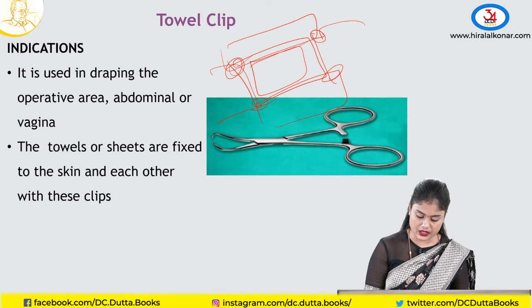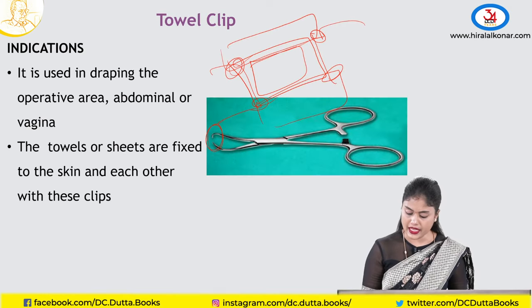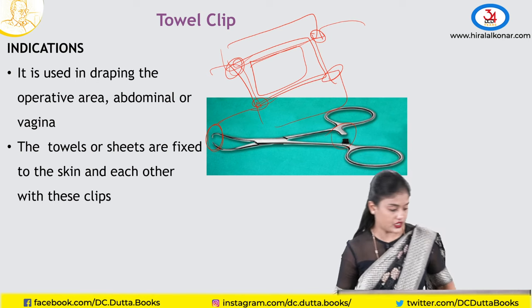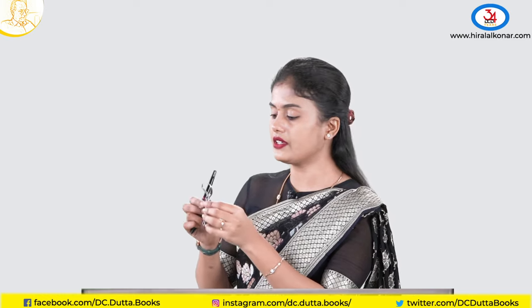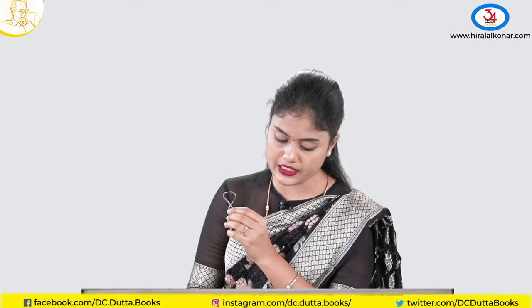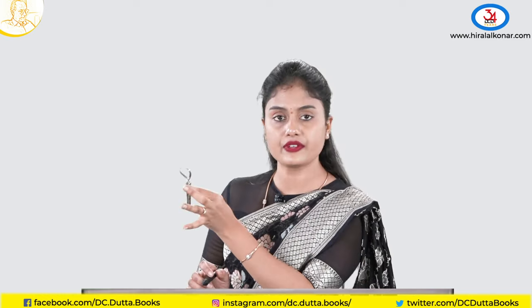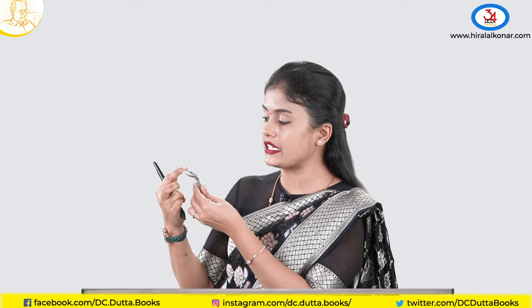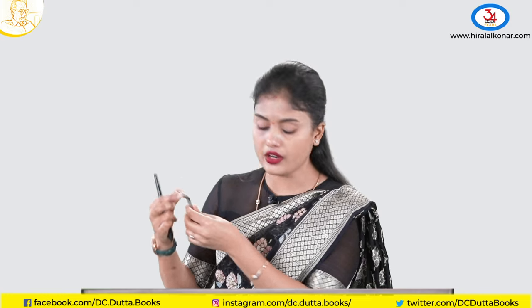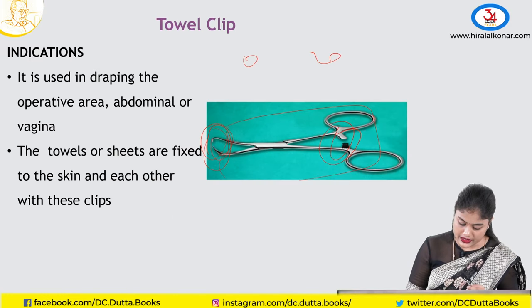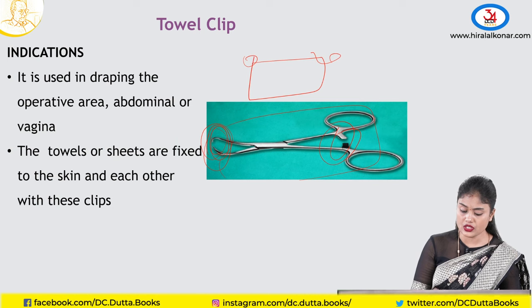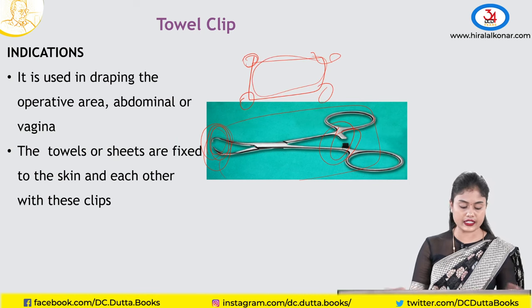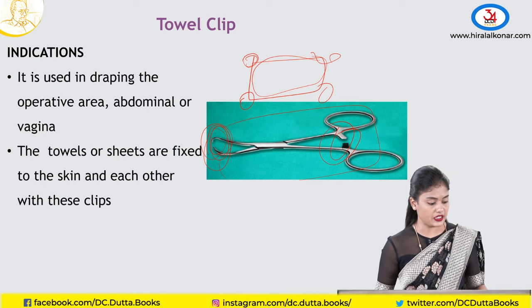The towel clip has a tooth tip and a lock — you just hold the drapes with it and lock. This is the lock and this is the tip of the instrument. We use it to drape the surgical site so that only the surgical site is visible and the rest of the area is covered with the green sheet.